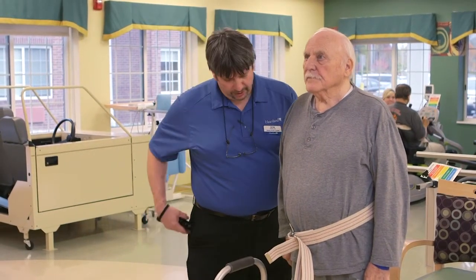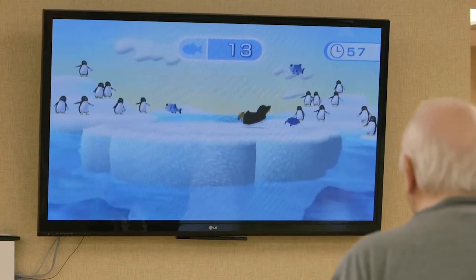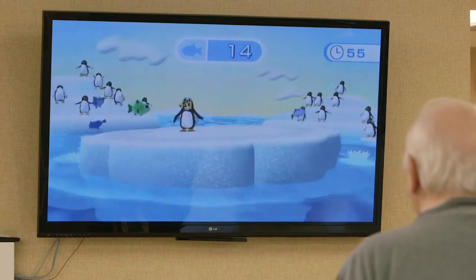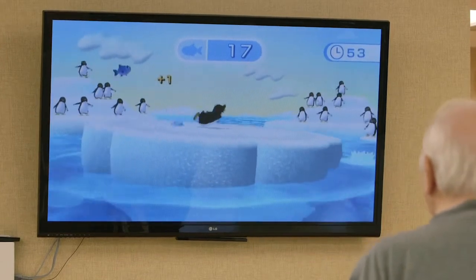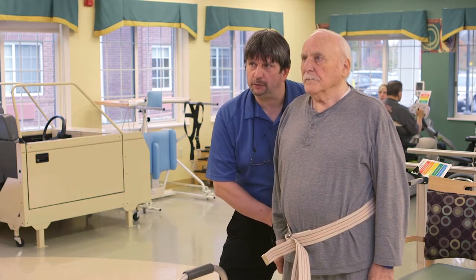Three, two, one. Good. So you're going to shift your weight from side to side — catching the fish, that's what I want you to do. Flex your knees, just bend your knees a little bit so it's easier to shift your weight.